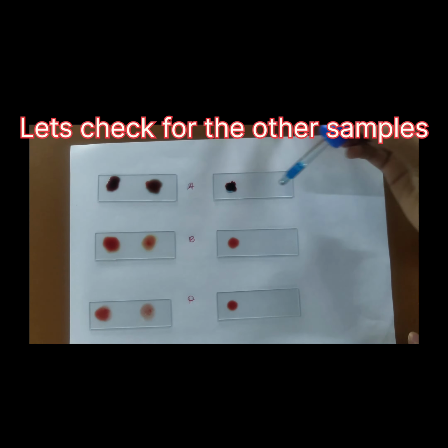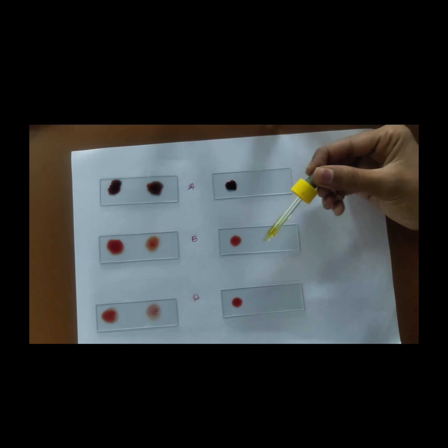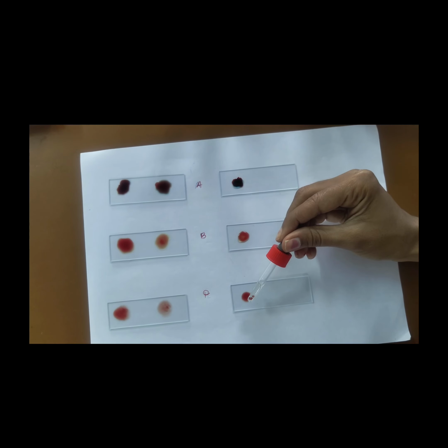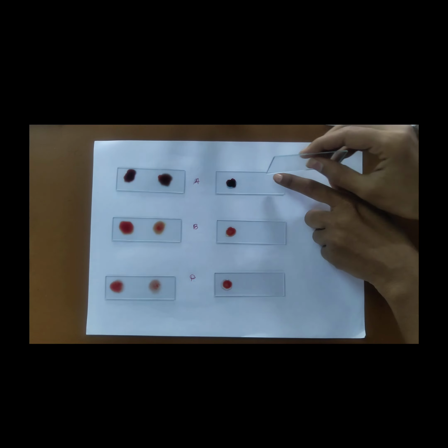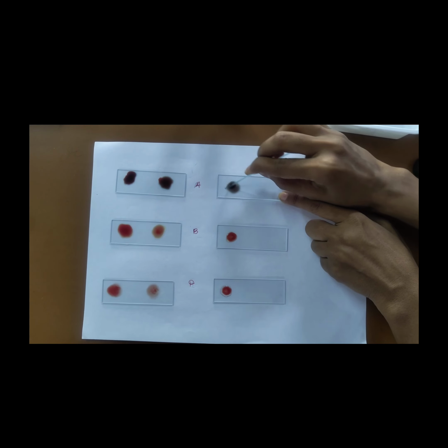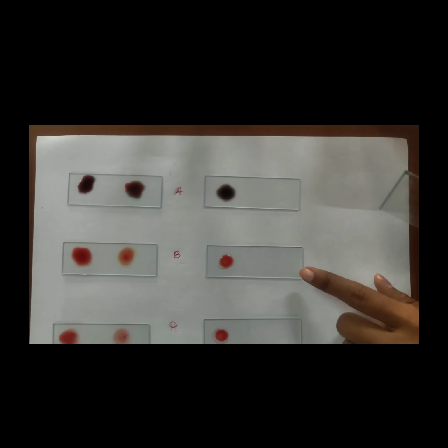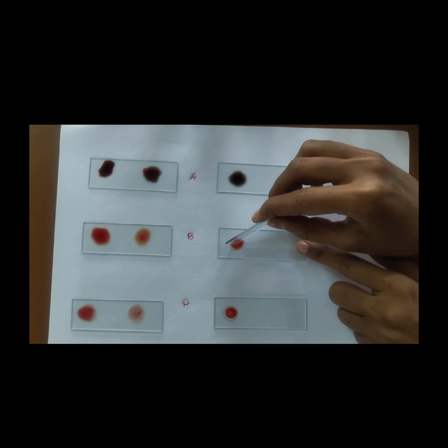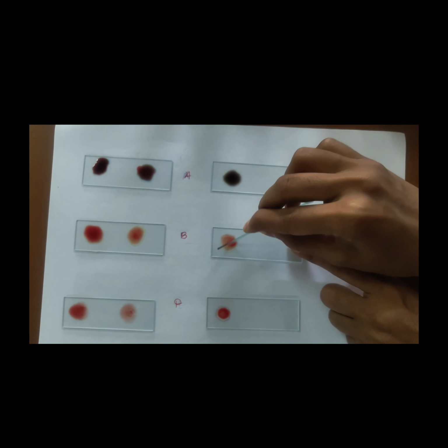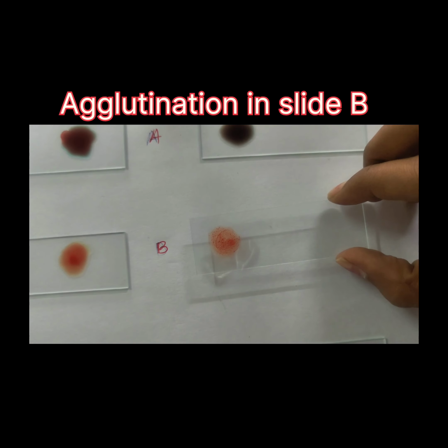Let's check for the second sample. Here we can see that there is no agglutination in slide A, while there is agglutination in slide B, we can see the clumping of RBCs.